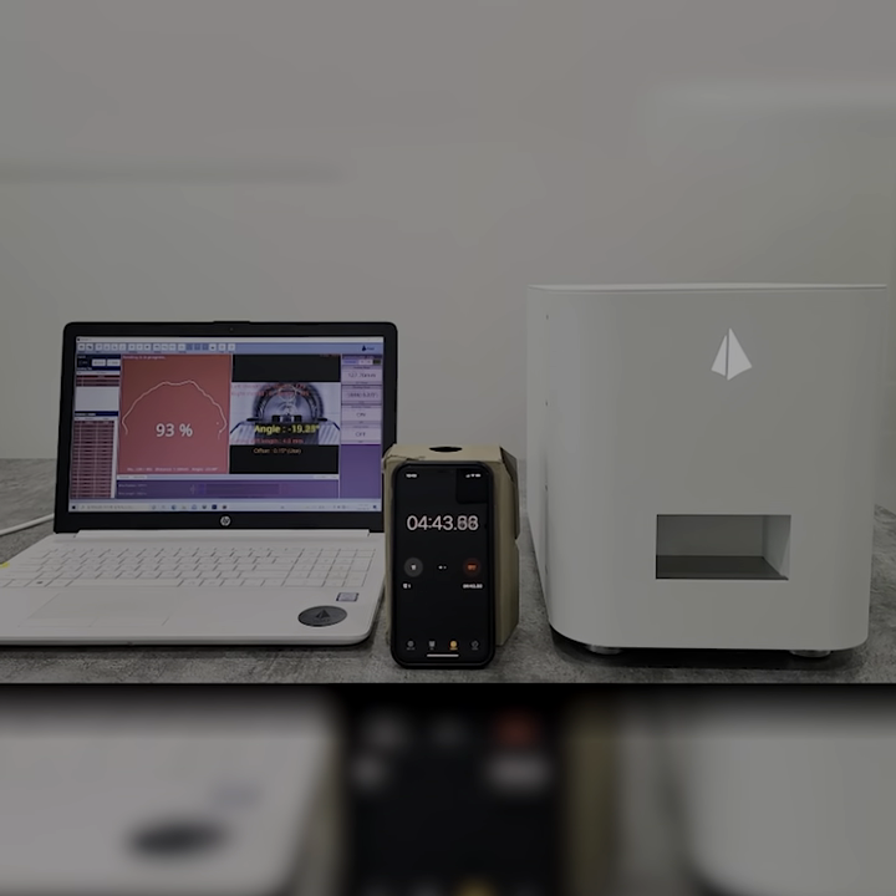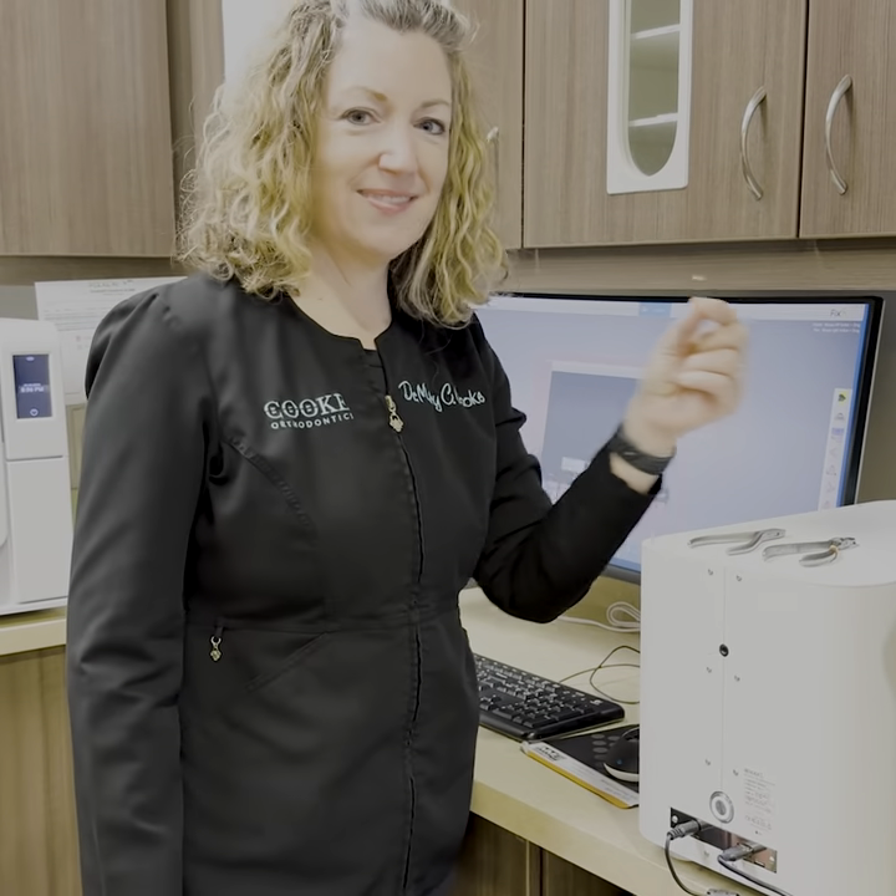I have purchased another Yolt Wire Bender for my second office and everyone is so happy. I'm able to do upper and lower bonded retainers in one appointment — from scan to fabrication of the retainers, about 10 minutes.